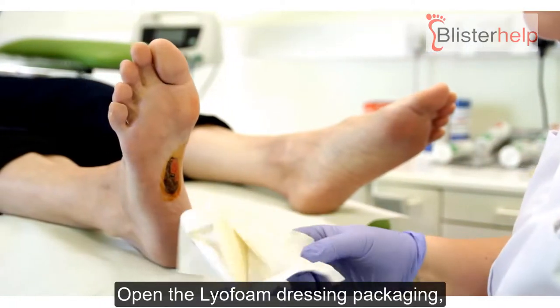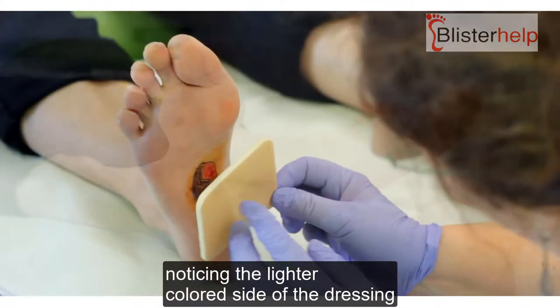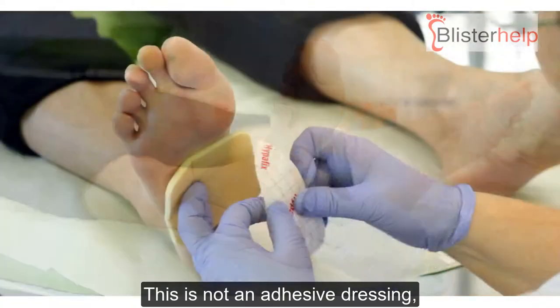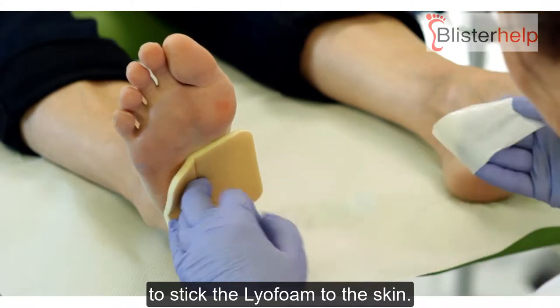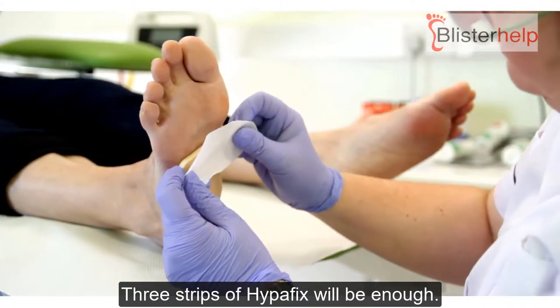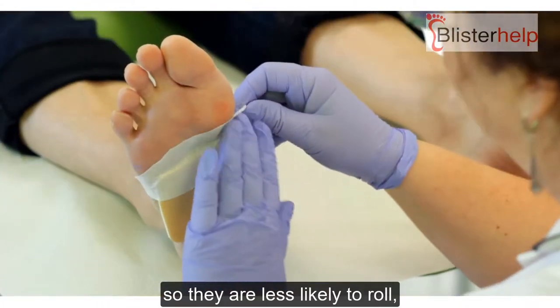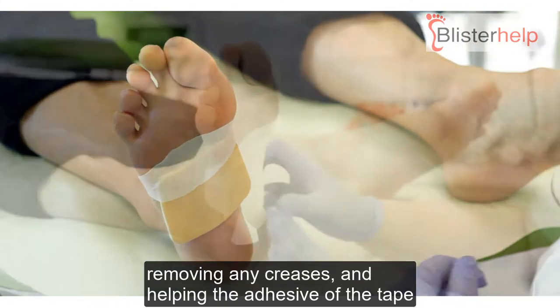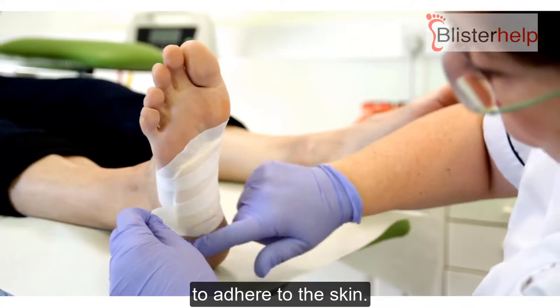Open the lyophane dressing packaging, noticing the lighter coloured side of the dressing goes to the skin. This is not an adhesive dressing, so you will need Hyperfix tape to stick the lyophane to the skin. Three strips of Hyperfix will be enough. Round the edges of the Hyperfix so they are less likely to roll, and smooth the tape with your fingers, removing any creases and helping the adhesive of the tape to adhere to the skin.